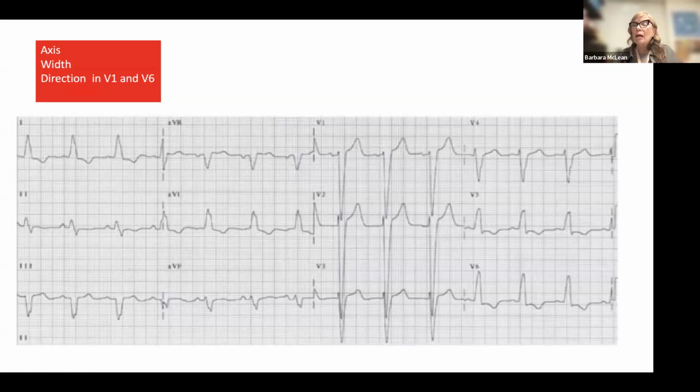You want to remind yourself that the number one reason for false activation of a STEMI is left bundle branch block. Because with left bundle branch block, you get this ST segment elevation in V1, V2, sometimes in V3, with these big peak T waves. And if you're not knowledgeable about an EKG, you would say, oh, the patient's having an anterior septal MI, it's got ST segment elevation. About 90% of false activation of STEMI is left bundle branch block.